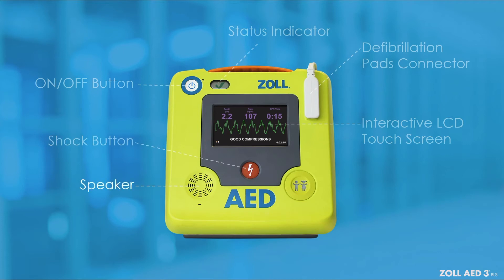The speaker provides audio prompts and metronome beeps to guide rescuers during a rescue. It also provides audio prompts to indicate when service is required.